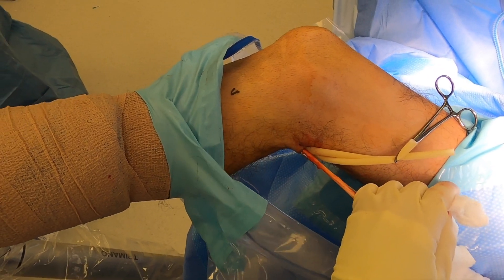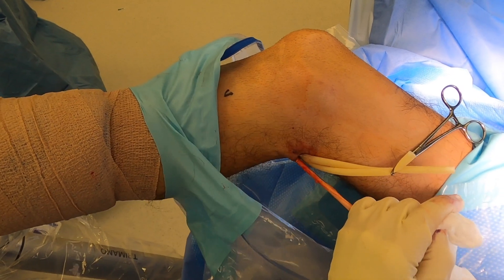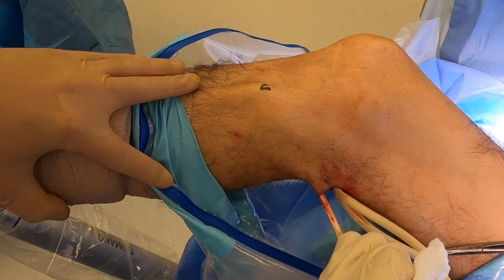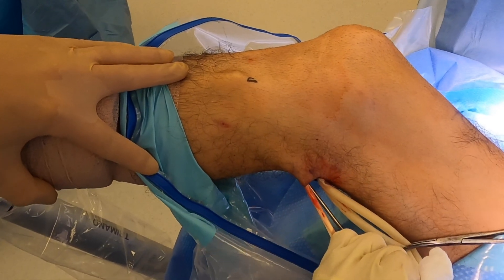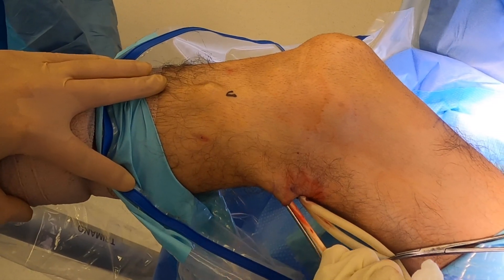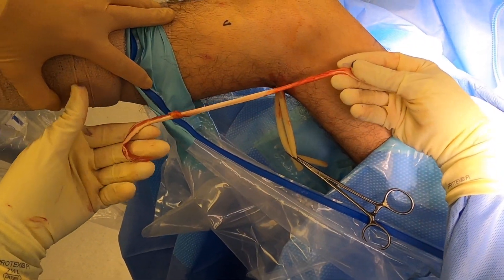With the posterior approach, you usually don't have to worry about the accessory attachments the way you would when harvesting from the front of the knee. I can just keep tension with my hand on one end and push it all the way until I see it tenting the skin in the region of the pes, and it pops out.